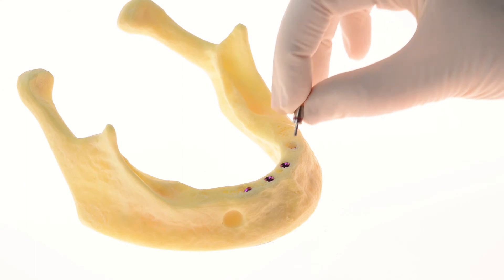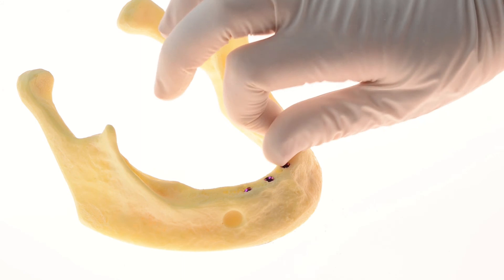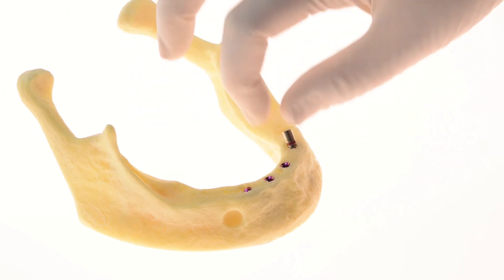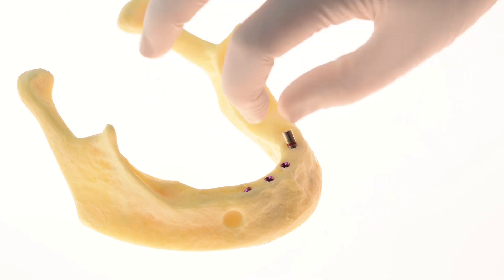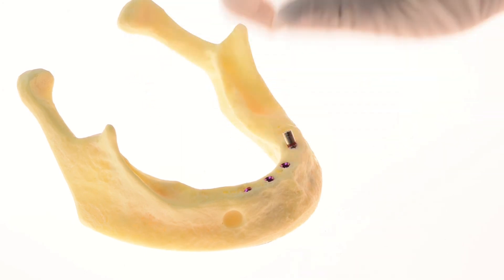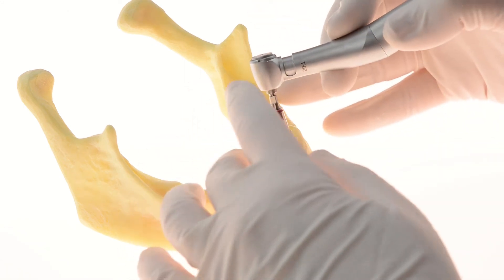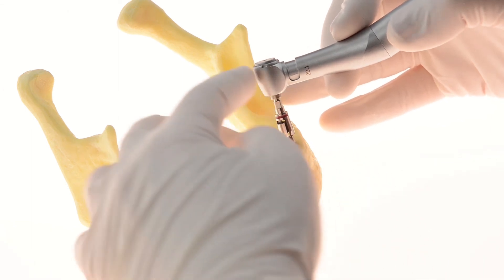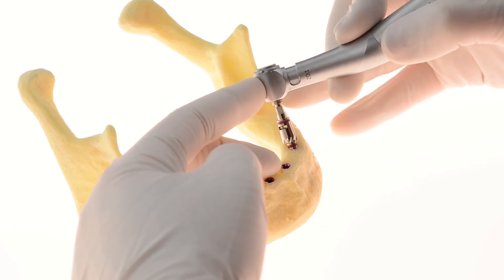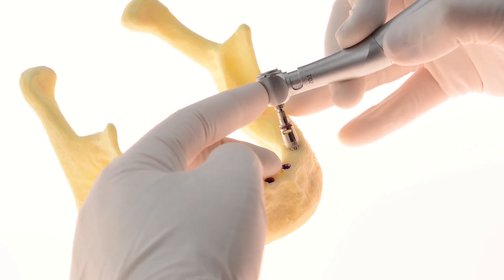Manually connect the bone profiler guide pin to the implant using a maximum torque of 10 newton centimeters. Perform the milling with the profiler using the handpiece at a maximum speed of 200 RPM. After bone profiling, a smooth path of insertion is achieved for the multi-unit abutment.